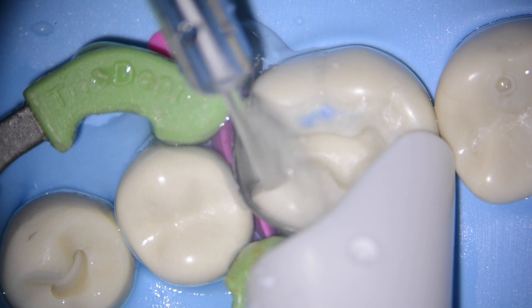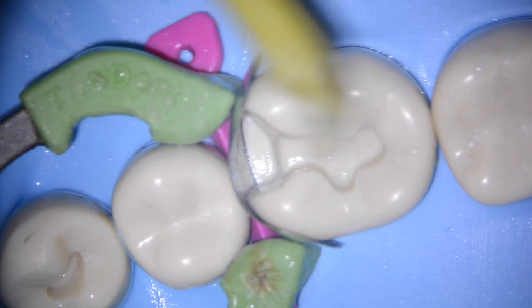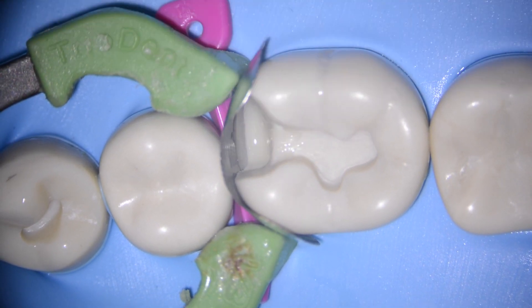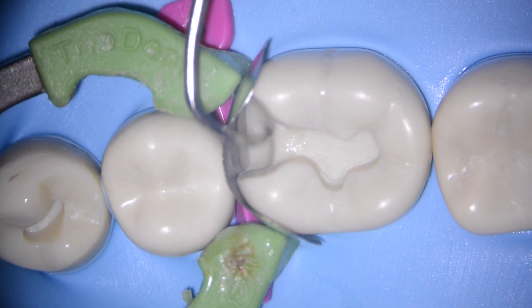The next steps I'm going to show are different for everyone watching, but this is how I layer my composite fillings. I start by etching and bonding the tooth. I use a Clearfil SE bonding system, which is an incredible product in my hands, but there are plenty of awesome bonding systems out there to choose from. It's really important to thin the bonding layer out so you don't have a thickness between the natural tooth and the composite resin. I always use a little bit of air to thin out the bonding agent. After that, I use a tiny amount of flowable composite along the gingival floor to achieve really nice adaptation at the bottom of the box. I cure that and then I do something called the centripetal layering technique.